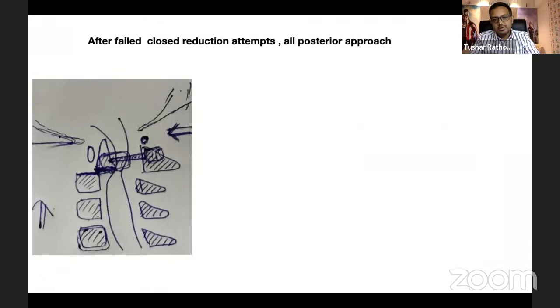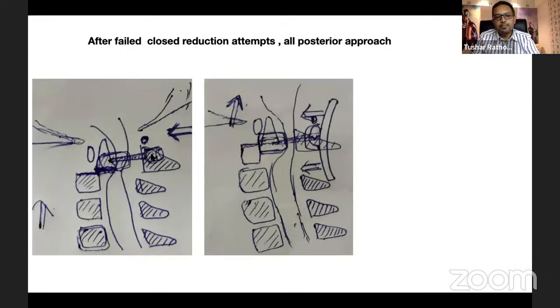So the problem was that we were basically maneuvering the C1 vertebra to get a reduction of C1 versus C2. We wanted to give a posterior-to-anterior force first with traction, which was a risk because under anesthesia we don't know how much the traction is. So we did a controlled traction, and we wanted the rod. We were pushing the rod slightly front. At the same time, my Penfield was between the C1 and C2 as a lever arm. And the rod was essentially used to push the C1 lateral mass anteriorly to get a reduction over the remaining part of the C2 vertebral body.